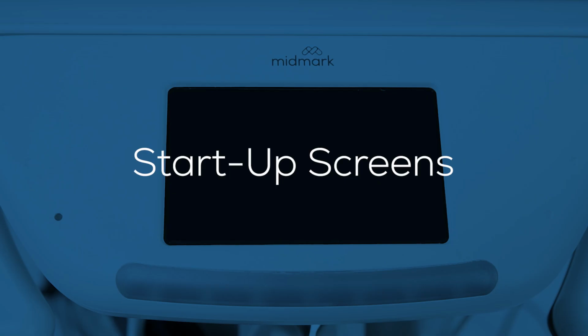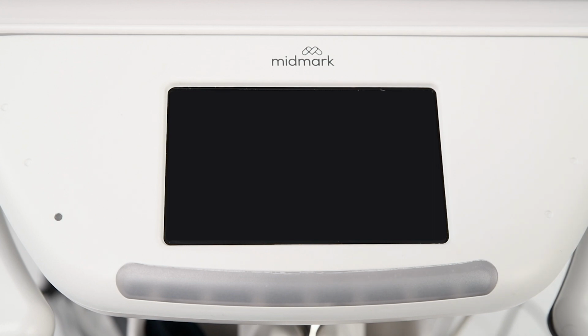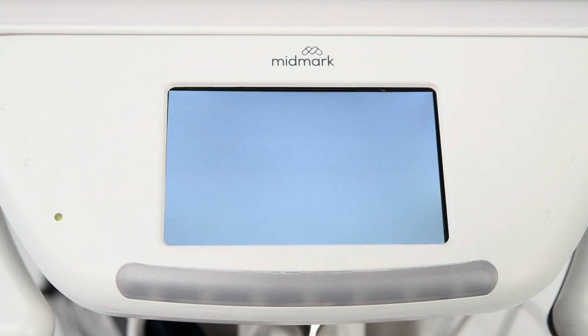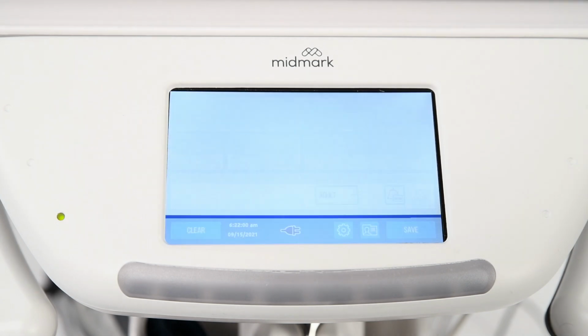When the unit is on, a green light will appear in the lower left front of the device's top surface. Startup screens. The IQvitals Zone device will display two screens before the main screen appears. The Loading Programs notification screen will appear first, followed by the Midmark logo screen.